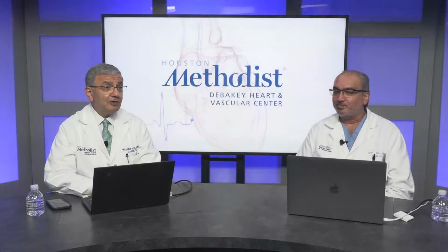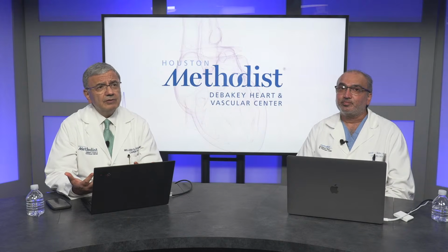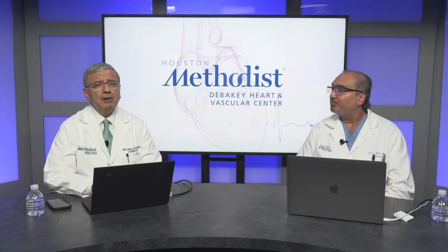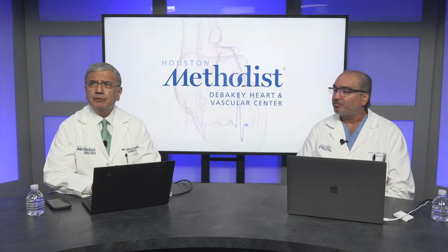The converse is true also. If you have a large ventricle and with a regurgitant volume of 60 or 70 or 80, the regurgitant fraction may not be above 50% or 60%. So I think they should go together for us to be able to make a determination. But I think moderate and above should raise concern from an overall outcomes point of view.